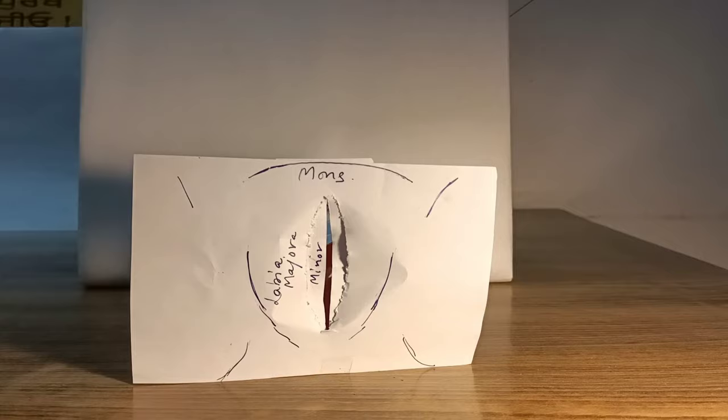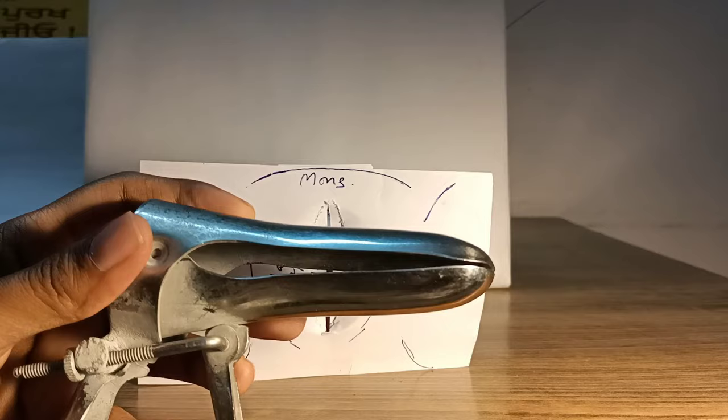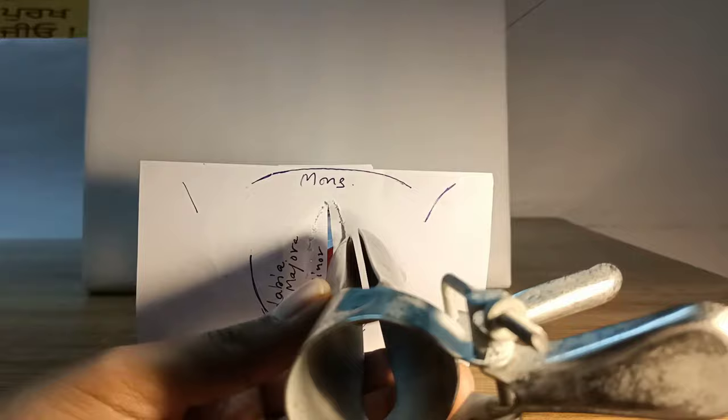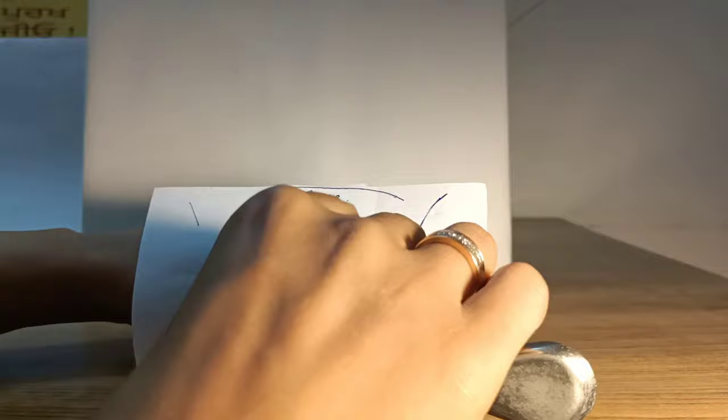Cusco's speculum is for the retraction of anterior and posterior vaginal walls, but we don't introduce it as such - it's very traumatic for the patient. So you rotate it 90 degrees, then insert it right through, and finally rotate it and open.